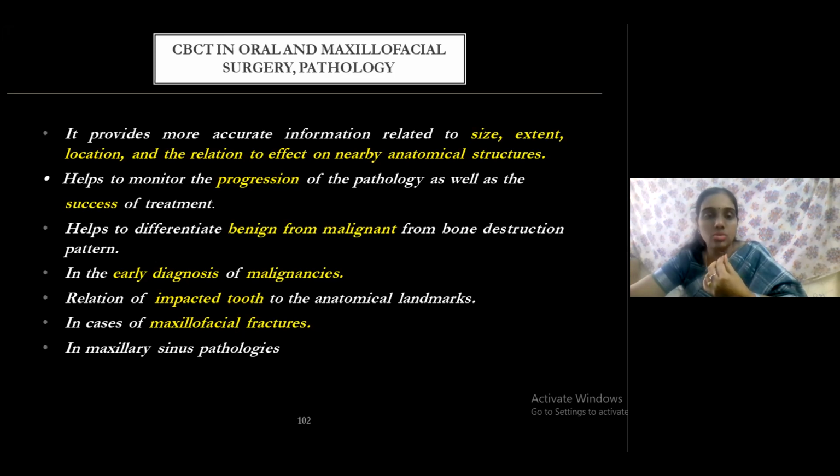impaction cases. So in all these cases, CBCT is of great use to exactly locate the size of the lesion, the extent of the lesion, the relationship to the anatomical structures, and the expansion of the jaws, and to differentiate between benign or malignant. It is also useful in early diagnosis of malignancies because of better spatial resolution.